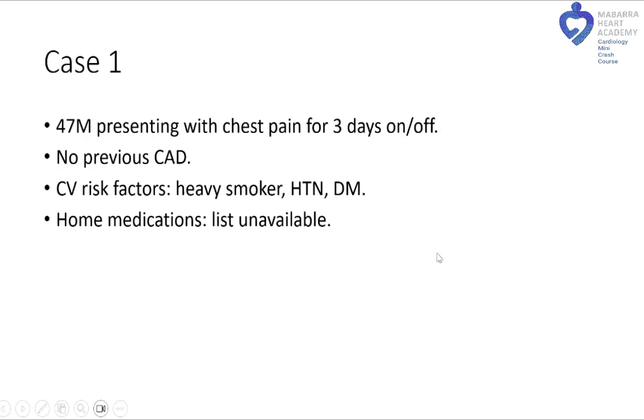Okay, I can see a question. What is your take on IVL in calcified nodules? I believe IVL can be a good option. I think IVL can be used in calcified nodules, provided that you have a good lumen. If you can deliver the IVL balloon to the lesion, then it is definitely worth a try.